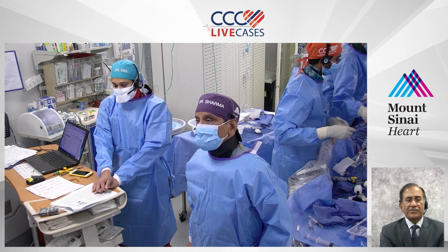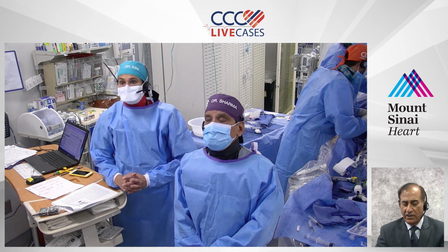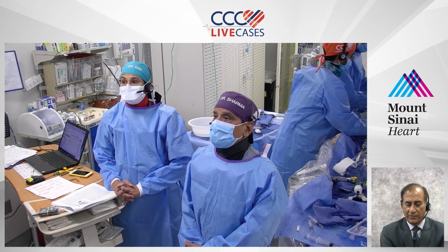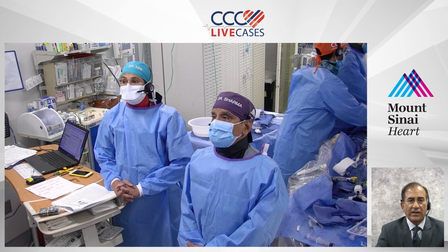Yes, Anu, some of the questions are related to what your strategy would have been if you were not able to cross with the support catheters, and what your strategies would be with different wires.